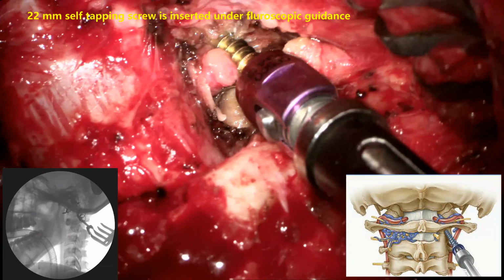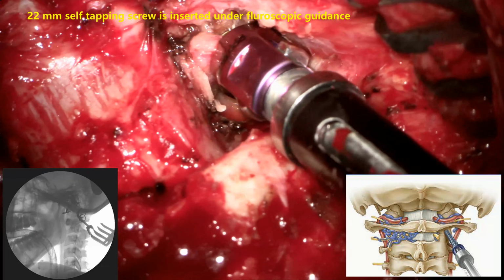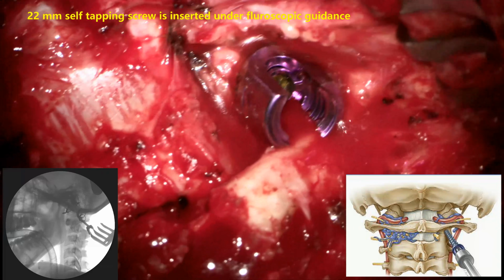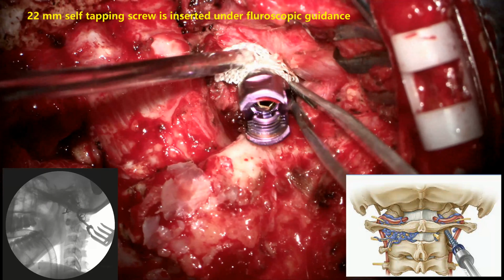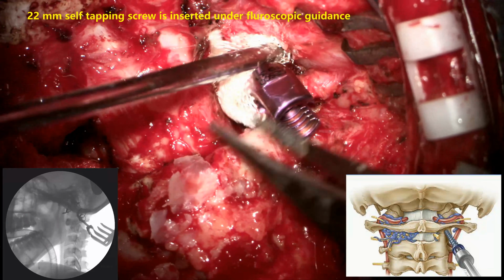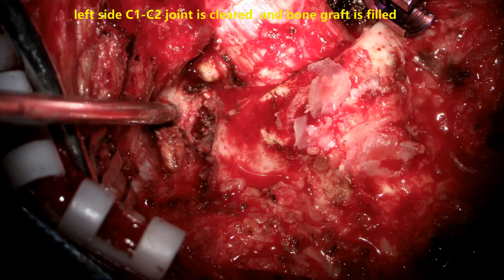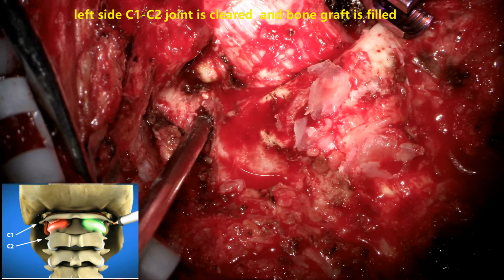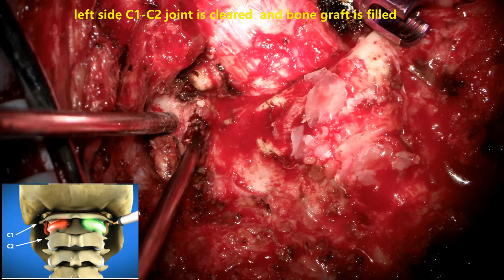A 22 millimeter self-tapping screw is selected depending on the preoperative CT scan measurements to insert, and very easily and nicely the screw goes inside the C1 lateral mass. There may be some amount of bleeding from the site of the screw insertion. You can stop it by using the Surgicel.